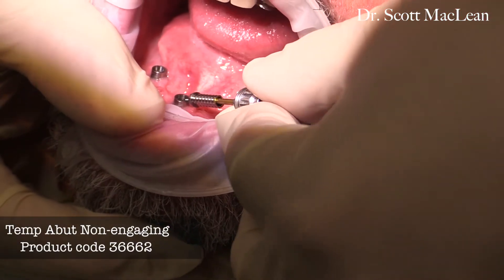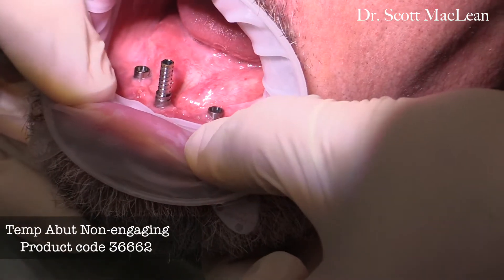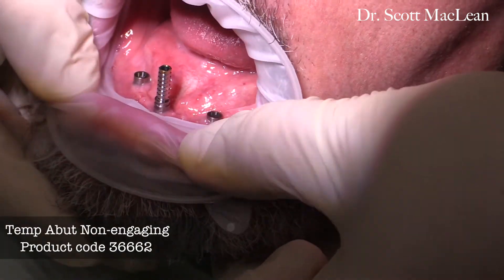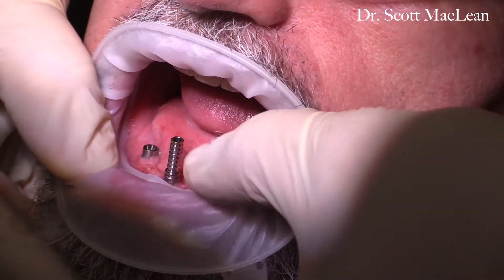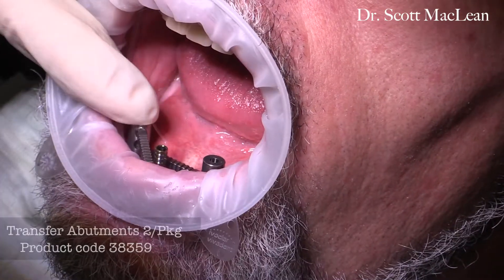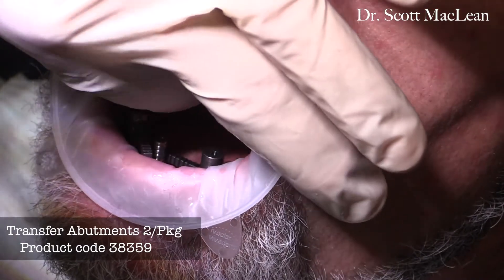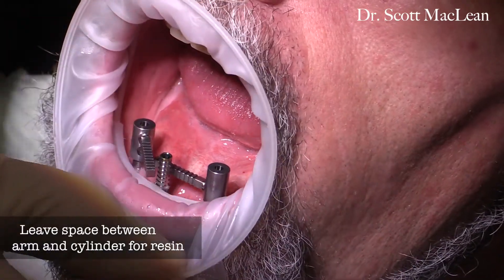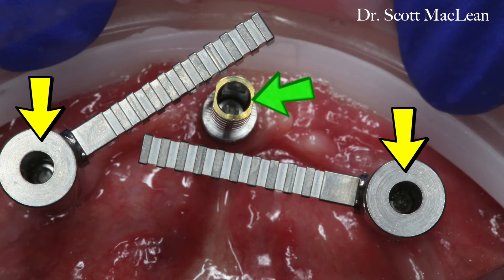First, we'll take a temporary abutment, which is a non-engaging abutment, and put this on the center implant, making sure it's in a good position and seated down on top of the implant. Next, we'll place the transfer abutments on the two posterior implants — one has a high arm and one has a low arm — and we'll strategically position these so that there's a little gap shown in red here. You can see the anterior cylinder and the two posterior transfer abutments with the long arms.